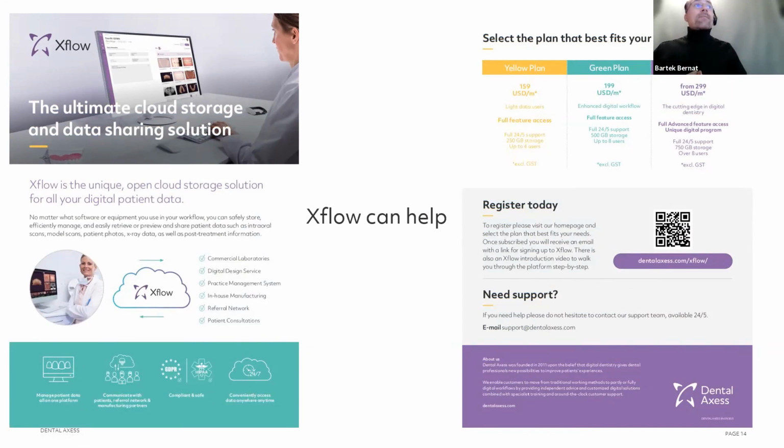And this Xflow portal can then be accessible to you, to your lab, to your other assistants, so they can use all of the features and get the scans, load them in, get them out, export, import, compare, all this stuff. So please contact our sales if you need to know more about it.